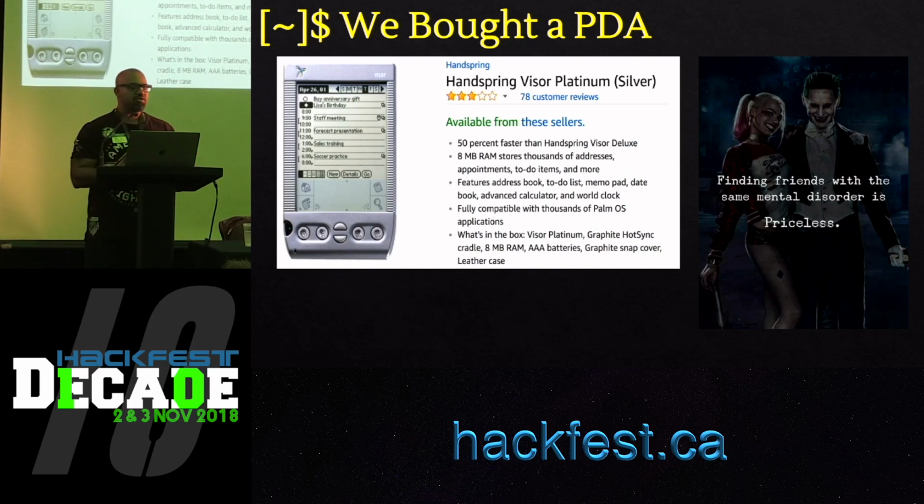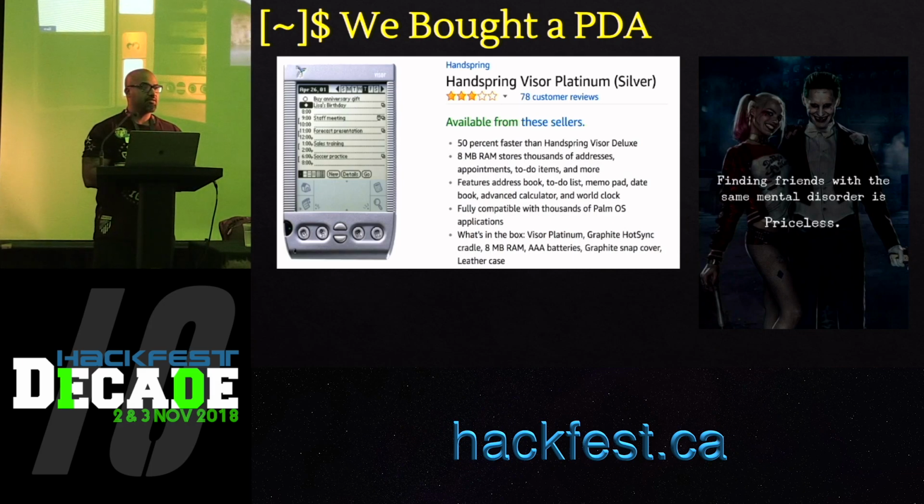So we were kind of stuck again, and at this point, we did what you typically do to a template. We filled it with our favorite wireless settings, and then ported it back to the infusion pump over IRDA. And out of everything else, that worked. Once we ported it back, it just overwrote all its wireless settings with the settings from our template. So at this point, we configured it with the username and password.